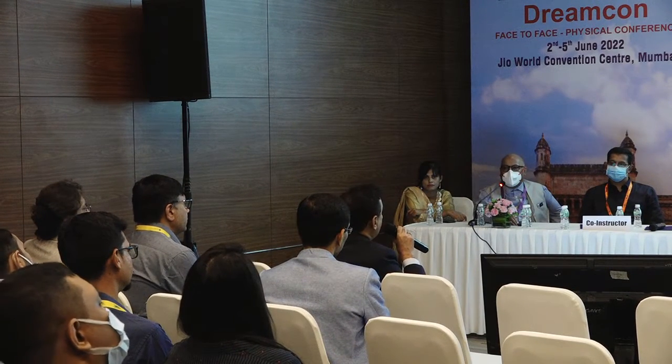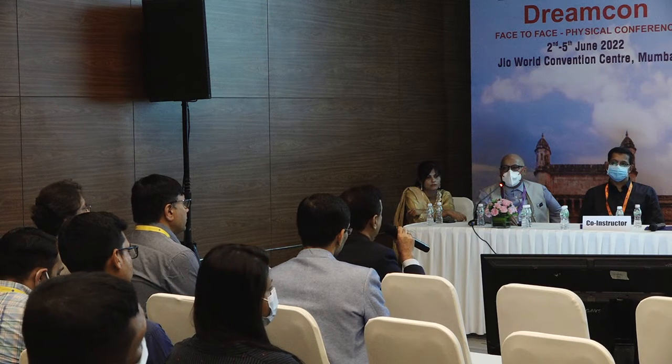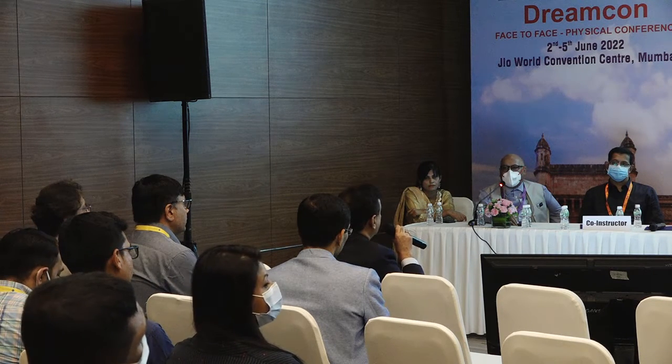Because of the 57 K, many IOL calculators did not accept a 57 K entry only to do the calculation. So that is where I was getting stumped, and I couldn't go to the next level only because they say beyond normal limits and it stops there. That was the problem I faced. Dr. Kumar, your patient is doing extremely well. So Hoffer-Q has worked for you. So retrospectively, it was a good conclusion.